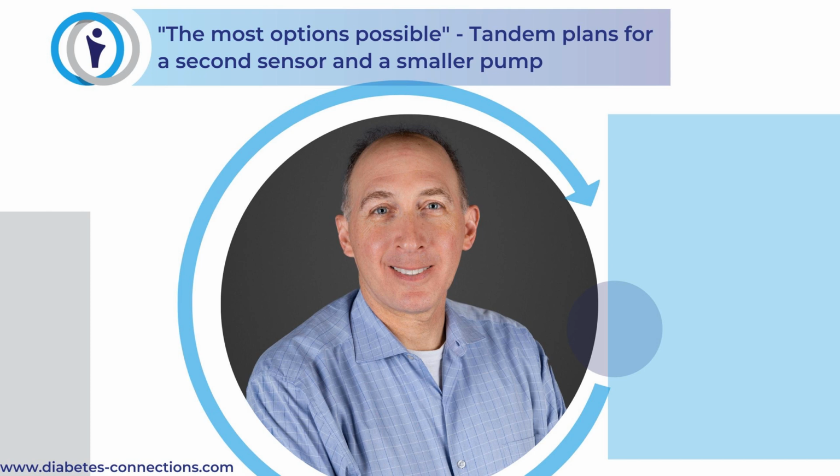Not to belabor the point, but just to be super clear on this. So in my head, I'm thinking, okay, one session, I've got a Libre on. I wear that for 2 weeks. And then I say, you know what? I want to try the Dexcom. And so I wear that the very next session. Can I do that with the Tandem pump? Is that something you're working on? Right. It's something we're working on. Our intention is not to make 7 different versions of a pump that would only pair to one sensor, for example. Exactly. Got it. So you could switch.